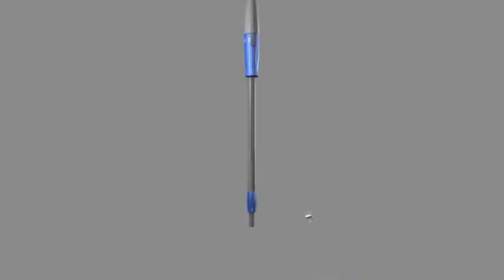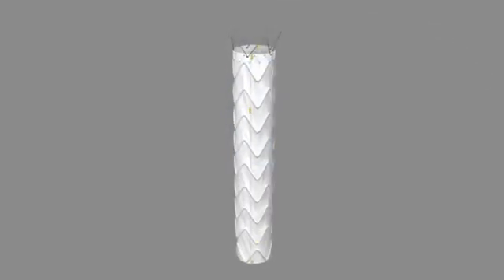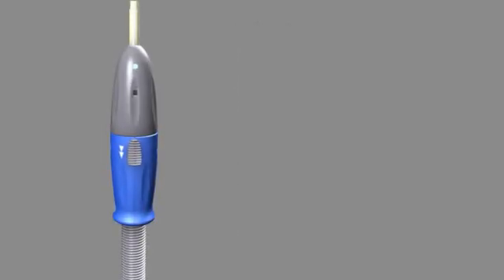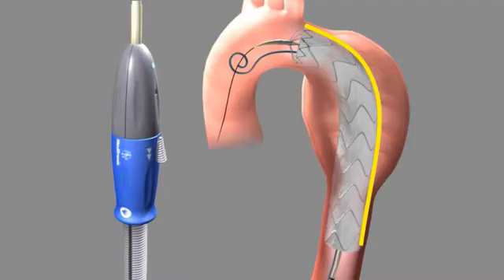Verify that the tip capture release handle is in its locked position. Inspect the radiopaque markers on the stent graft to locate the connecting bar within the sheath. Turn the delivery system to align the connecting bar with the outer curvature of the target vessel. An unaligned connecting bar may increase the likelihood of endoleaks post-implantation.